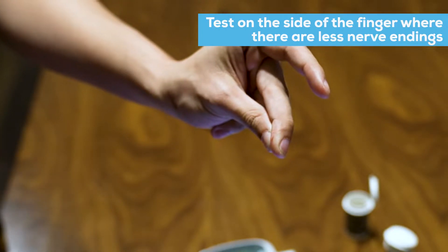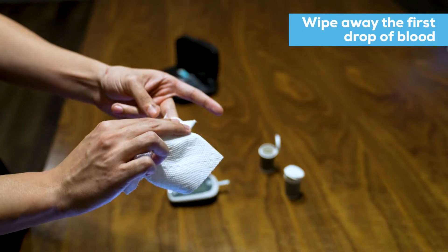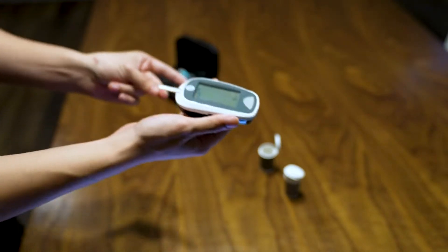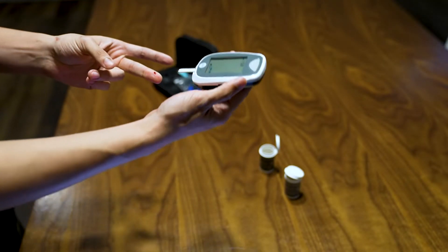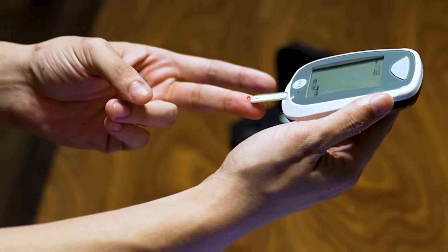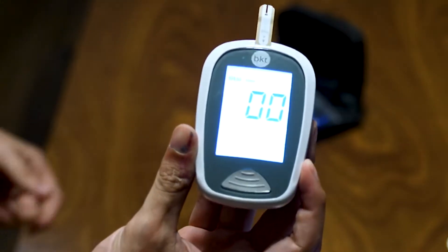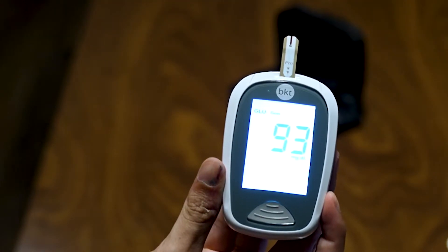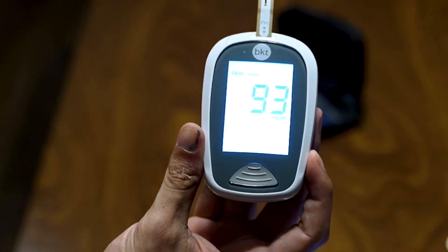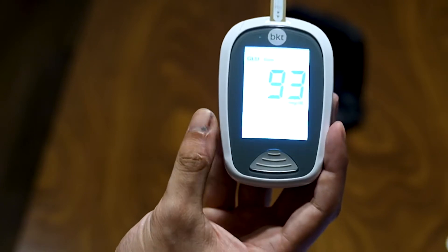The blood's coming out a little. We're going to wipe away the first drop of blood. Then we're going to sip up the second layer of blood. Now that the blood's flush, let me sip it up. 93 is absolutely perfect — so this is my glucose measurement.